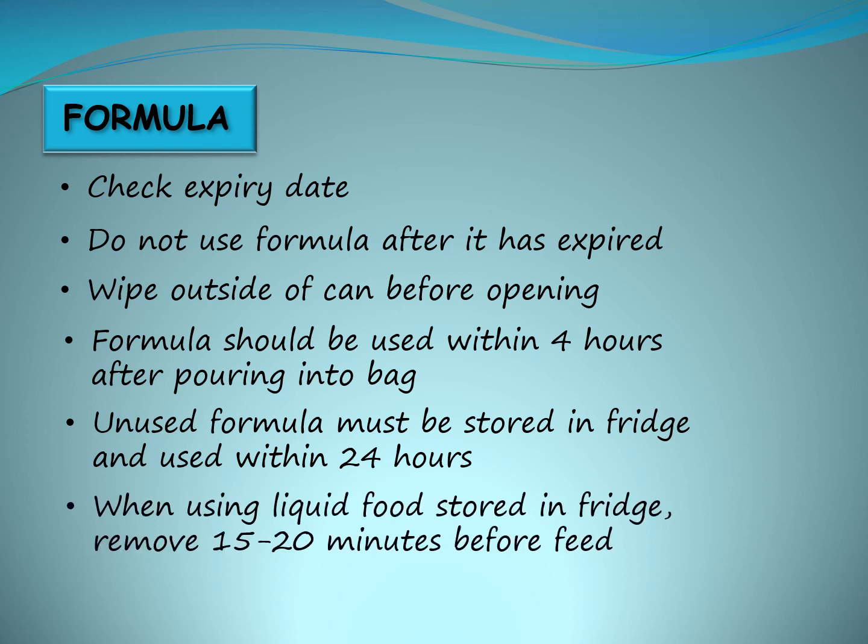When using liquid food stored in the fridge, remove from the fridge 15 to 20 minutes before the feed to bring it to room temperature. You can also place it in a container of warm water. Do not use the microwave to heat liquid food, as it can break down the proteins.